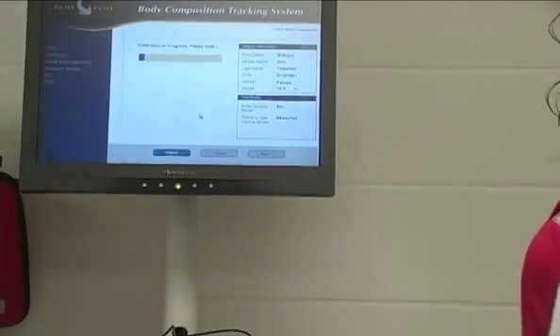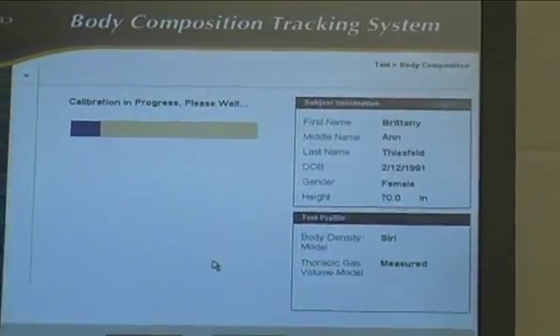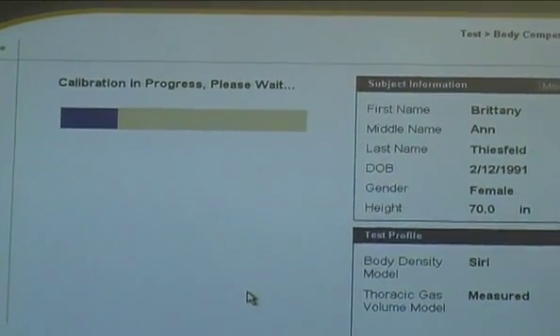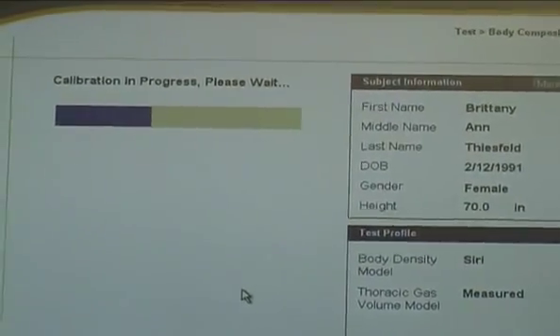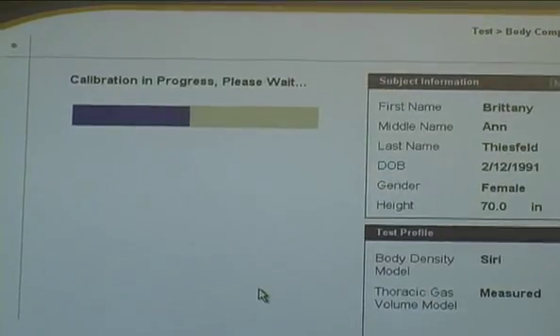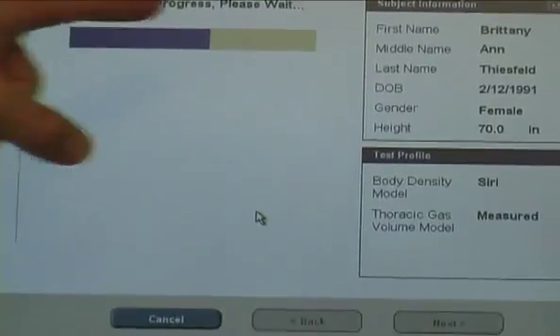So this is the built-in calibration. This is part of each and every test. One of the reasons the test is 5 minutes long is the first portion is entering the demographic information. Then the BOD pod is measuring itself. It's a known volume. This front chamber is about 460 liters. So it's going to go through that, and that's 50 seconds. You see the progress bar?